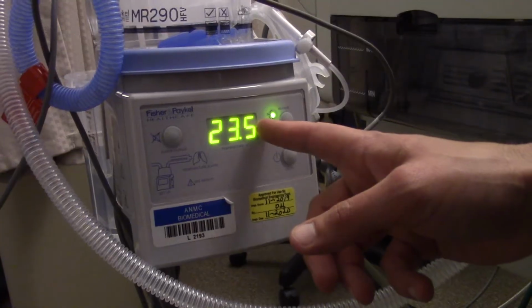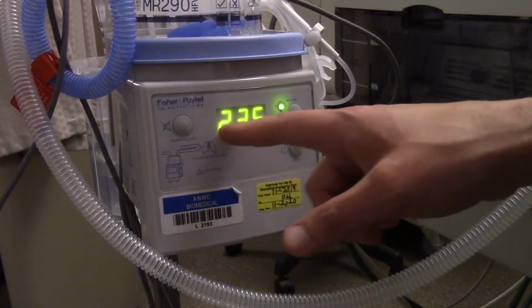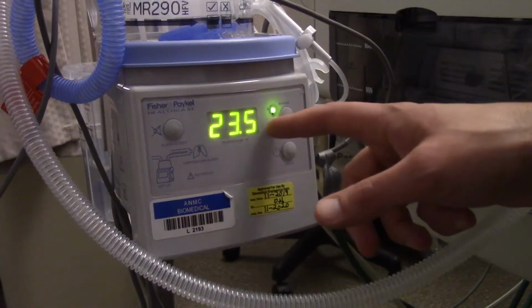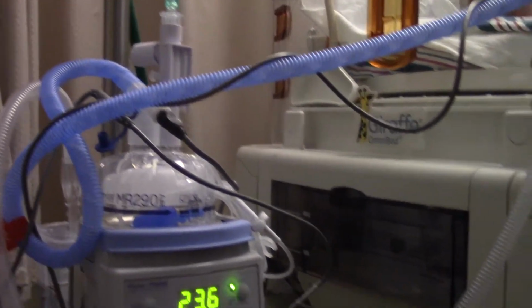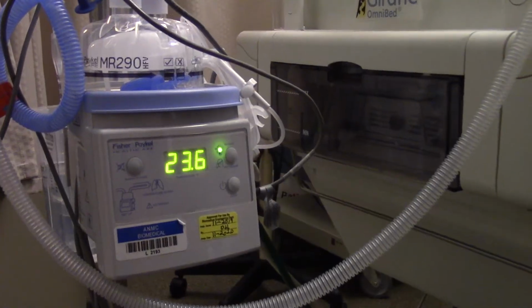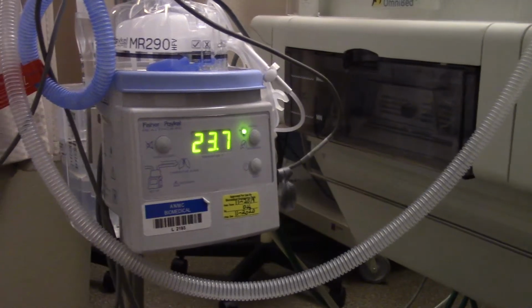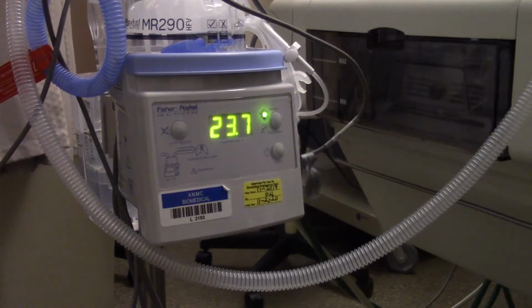Even though this is non-invasive, the reason that we've found running at 37 is a safer temperature is because that is our normal core temperature. As we all know, 37 equals 98.6 Fahrenheit, which is where our body temp is. So we want to heat up the air and the oxygen that's being delivered to the baby before it gets there. Otherwise, with these fragile NICU babies, I have seen where their core temperature can drop if it is set too low, or vice versa. If it's too high, we can lower the heater down, and that helps.